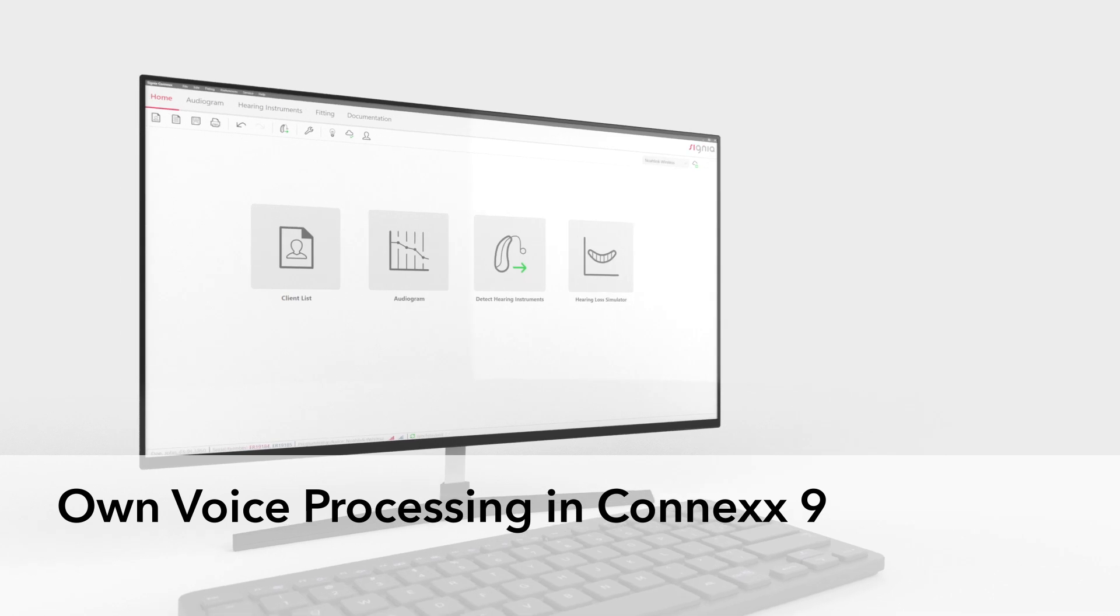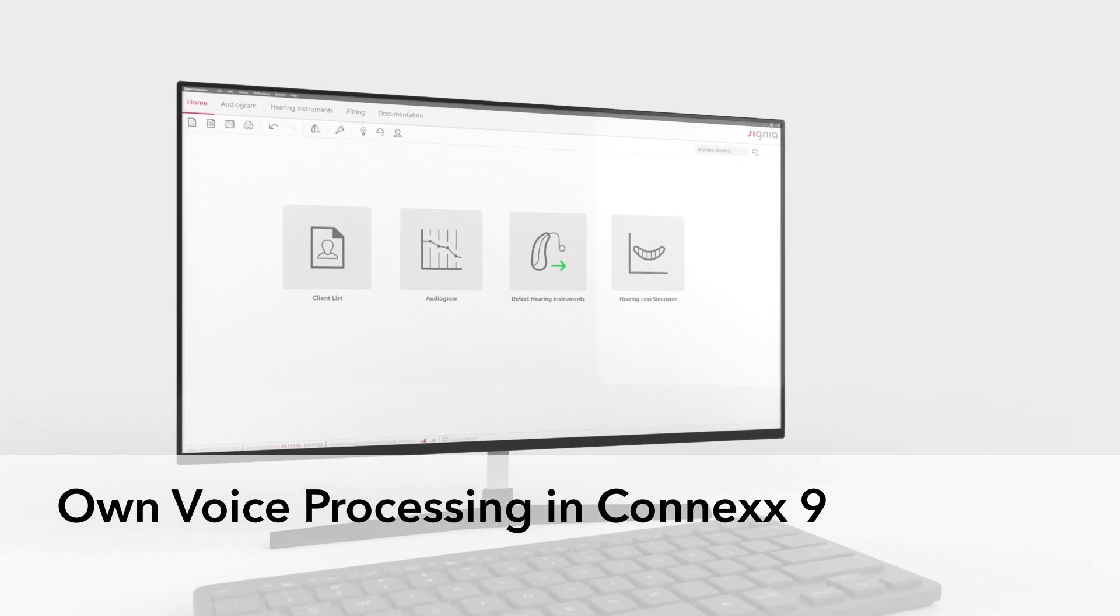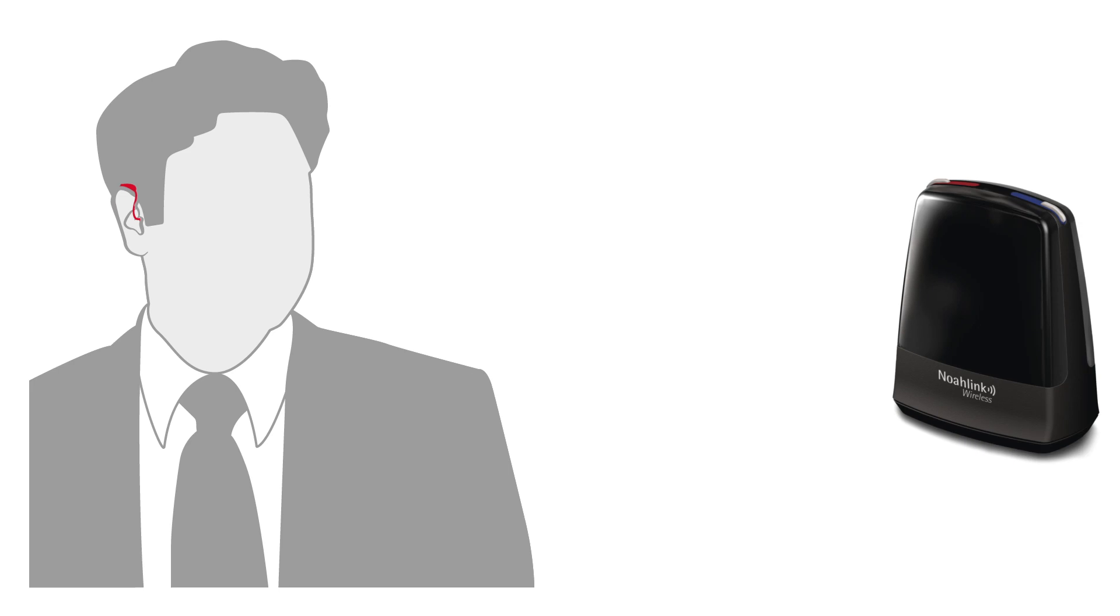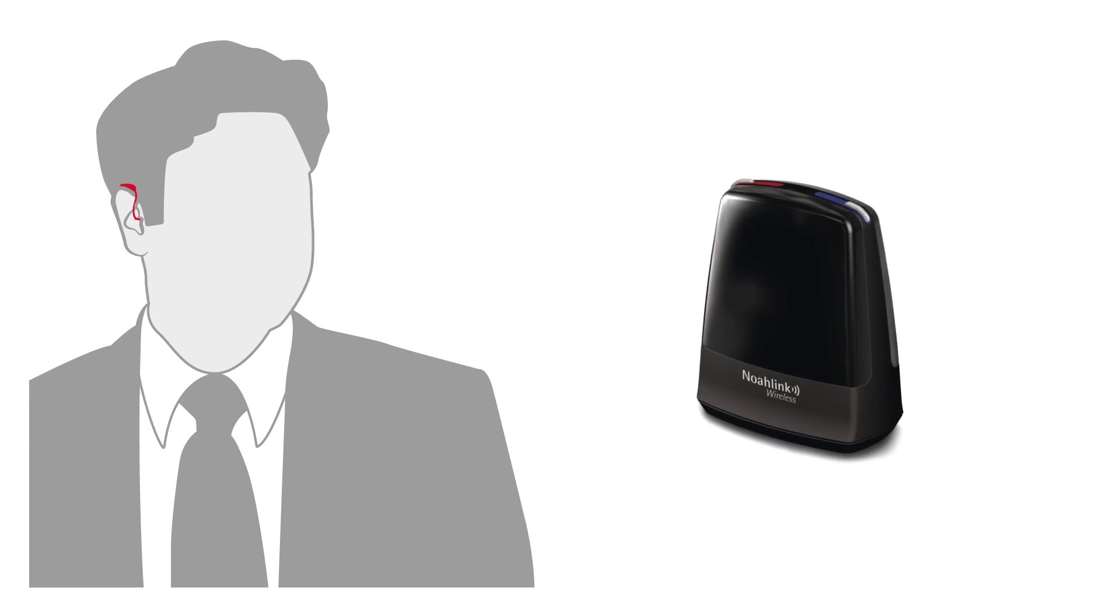Own voice processing in Connex 9. To use own voice processing, you will go through a short customization procedure with your client during the initial hearing aid fitting. It is highly recommended to use Noah link wireless during this workflow.